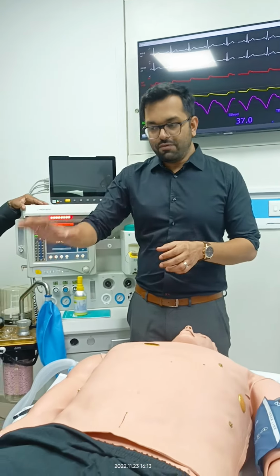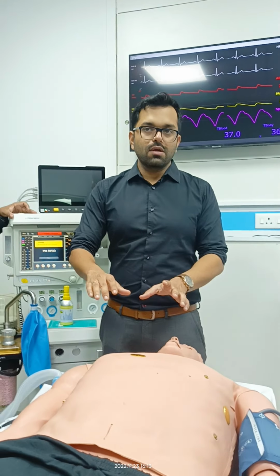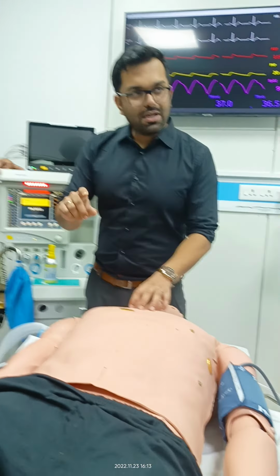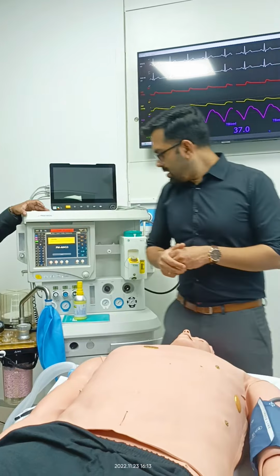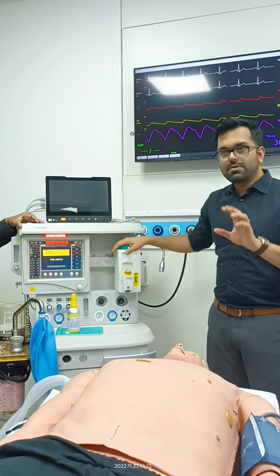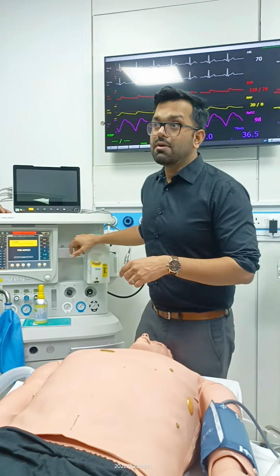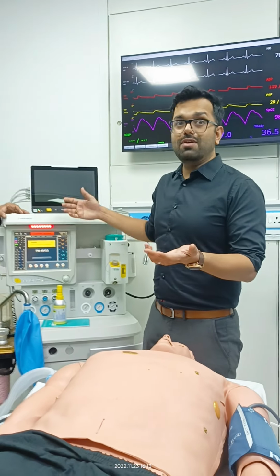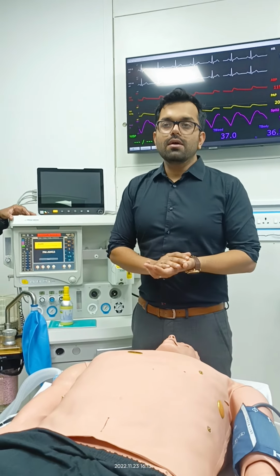Depending upon the anesthetic agent, we will remove a few parts. My first point was, to keep the patient alive we need oxygen, but we cannot give 100% oxygen, so we dilute it with compressed air.